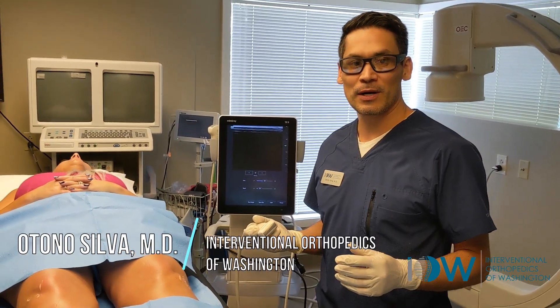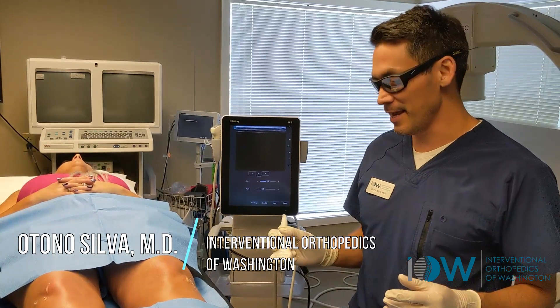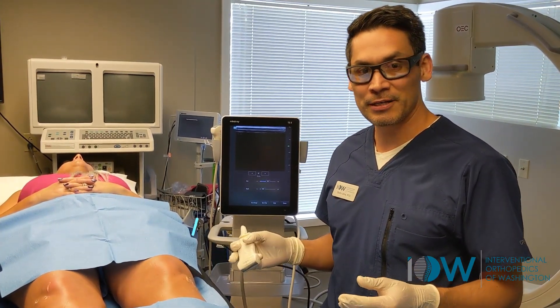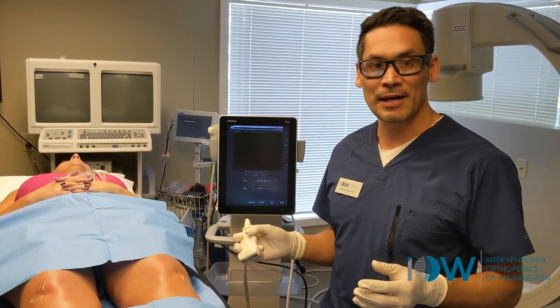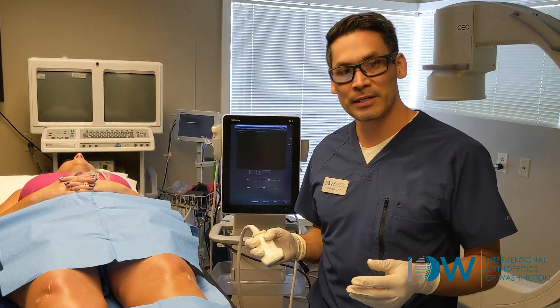Dr. Silva here at Interventional Orthopedics of Washington. We're going to be talking about treating loose ligaments in the knee today. I have a knee that suffered a medial meniscus injury, most likely due to this hypermobility of the knee. The lateral collateral ligament does have some laxity. I'll show you here on ultrasound, and then I'll show you how we treat it.